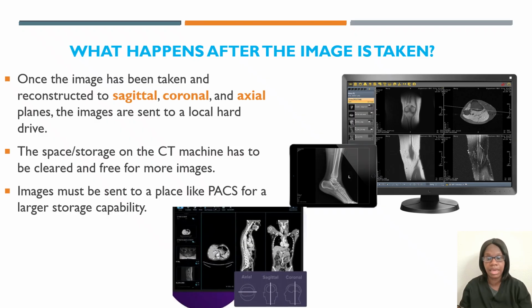Sometimes a radiologist may call over and say, hey, I didn't get all of the images from last night, or the tech forgot to send the images from 3 hours ago, especially if they have gotten busy in the ER or something. They'll say, could you please send them? So just start from the bottom of the machine, where it's like 3, 4, 5 months ago, to start deleting the images.